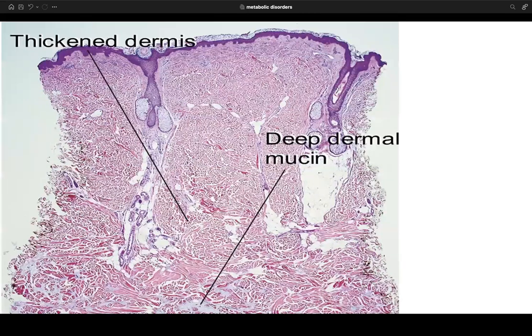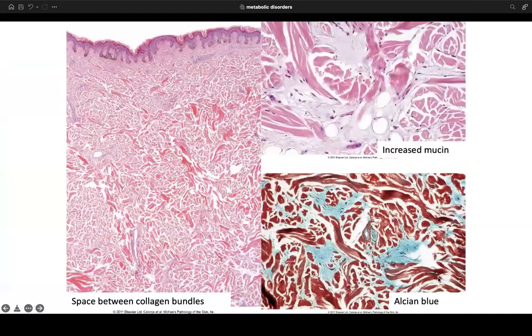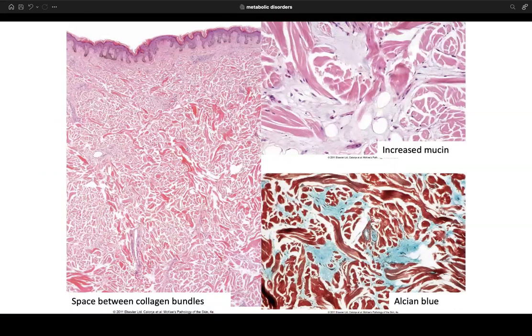On low power, a scleredema biopsy from the back may show a thickened dermis with deep dermal mucin visible even on H&E in prominent cases. In subtler examples, you see clear white spaces between collagen bundles. Alcian blue stain highlights the increased mucin, confirming the diagnosis.